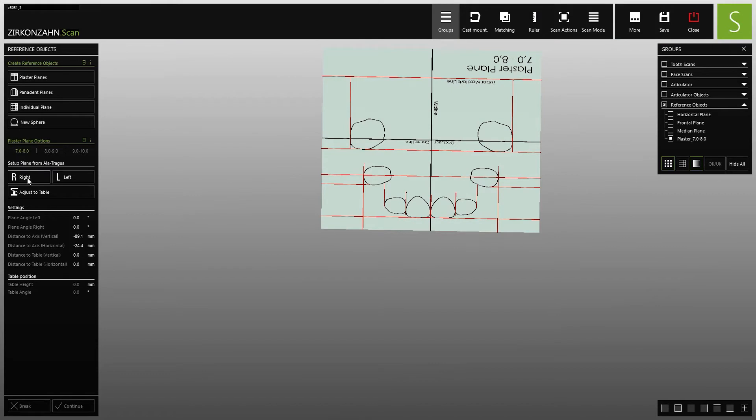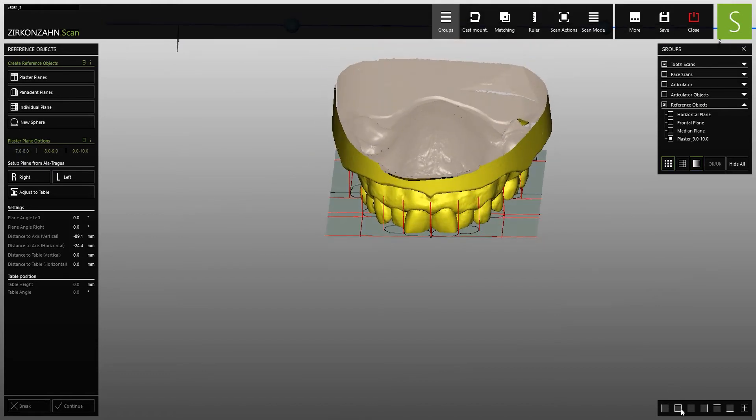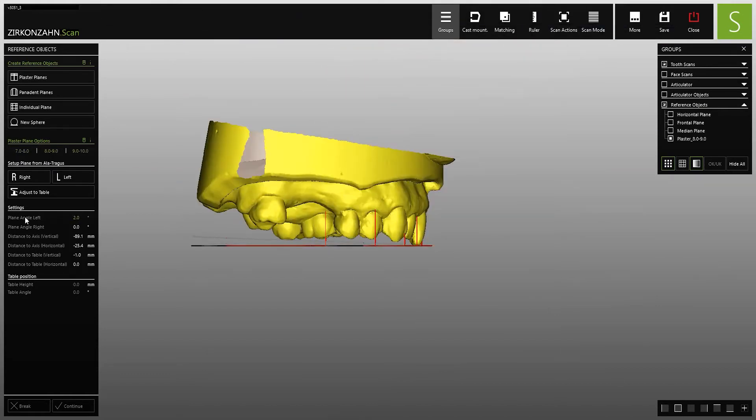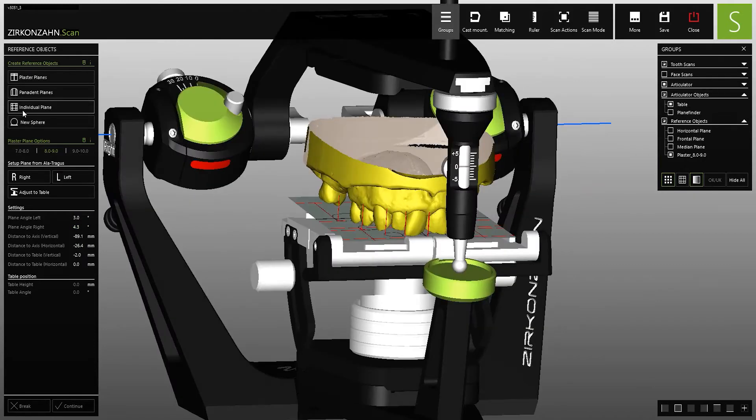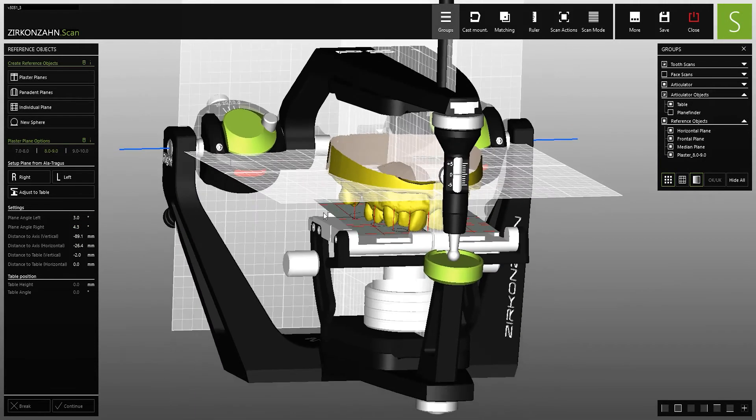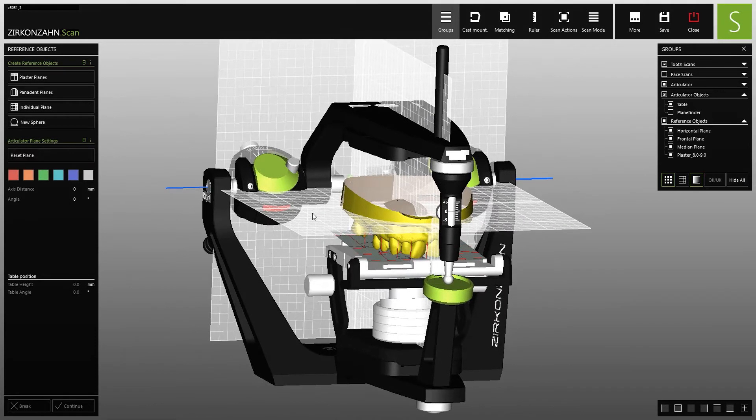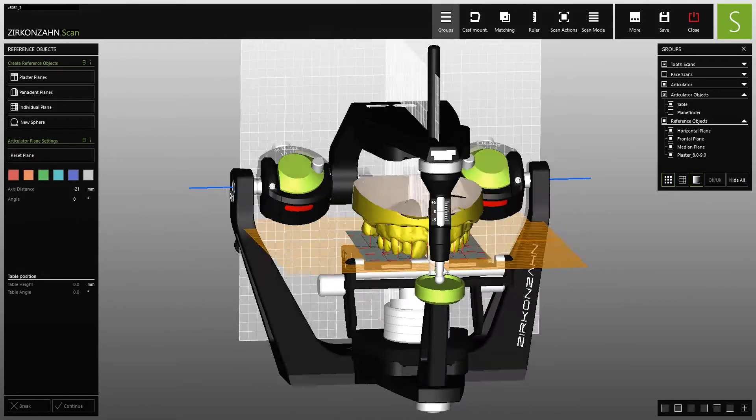For a correct tooth setup, it is important to select the plaster plane in the appropriate size and adjust its position and parameters. Here any number of individual layers can be loaded, positioned, and colored.